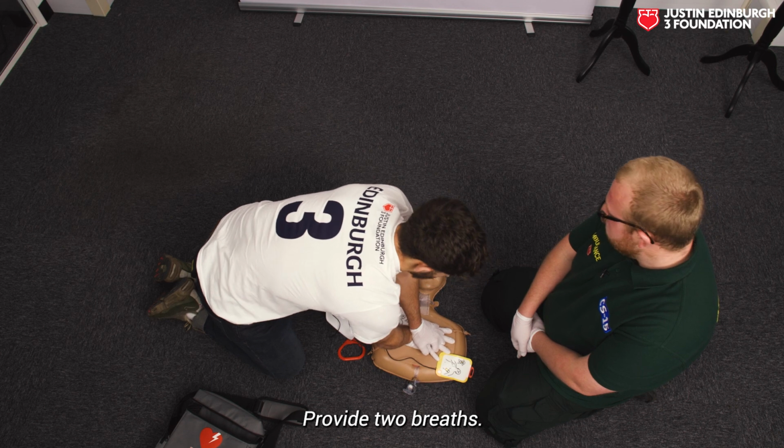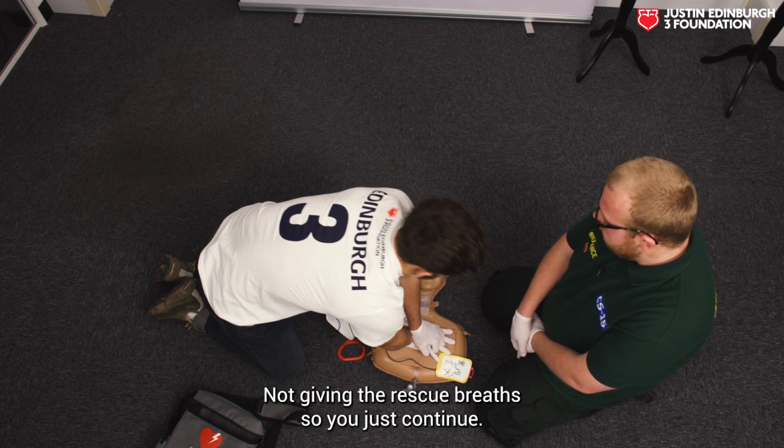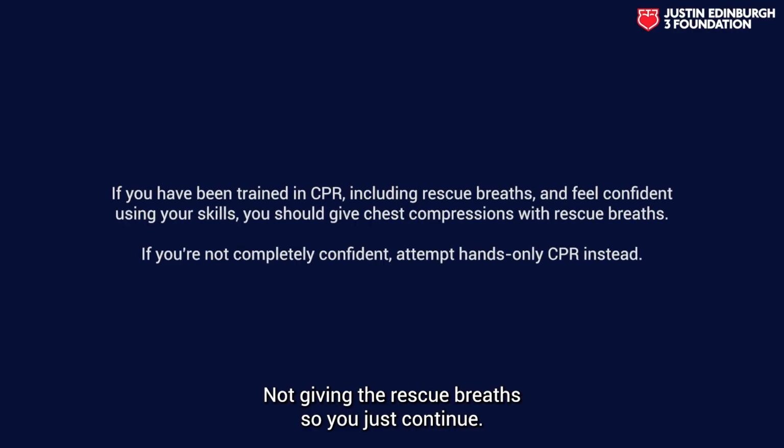Provide 2 breaths. Not giving the rescue breath, so you just continue.